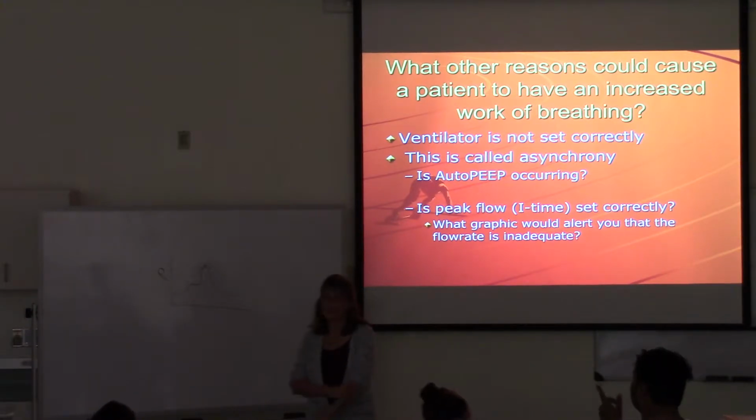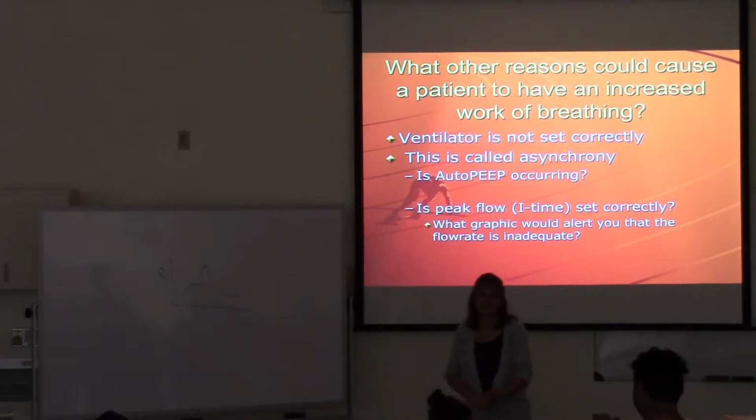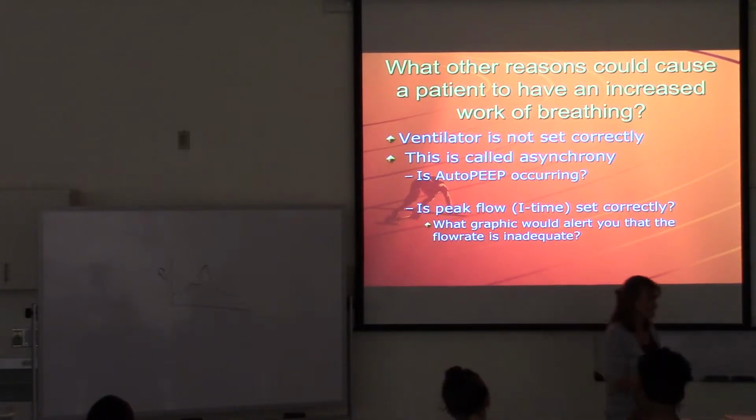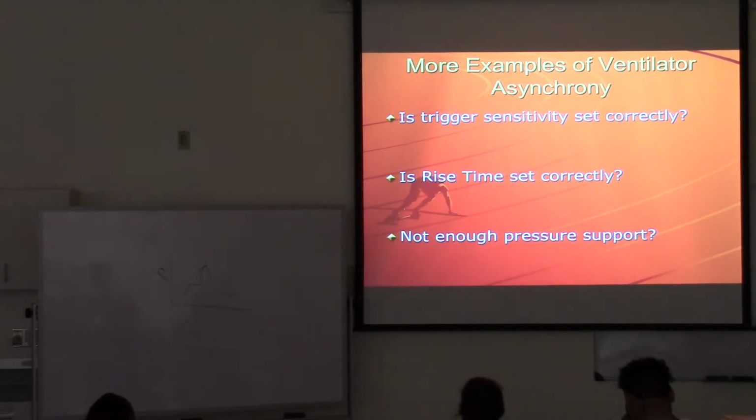Yeah. That one looks similar to the graphic we saw today. It just has an extra little line that comes up there. It's a strange graphic. There are some more examples of ventilator asynchrony.